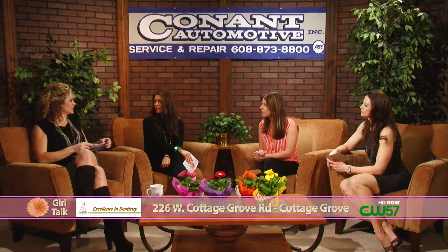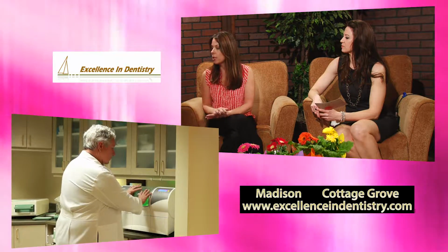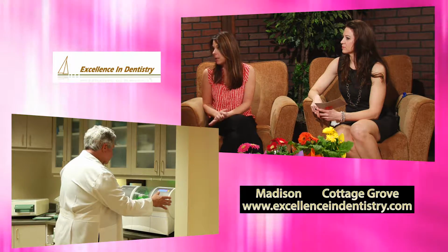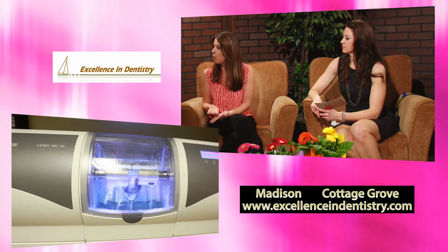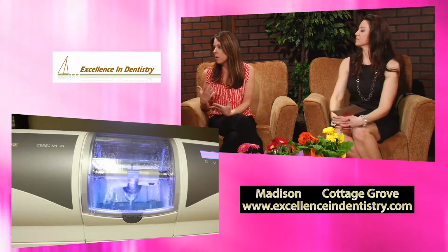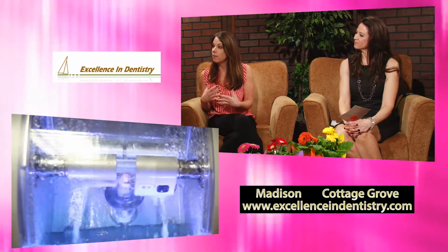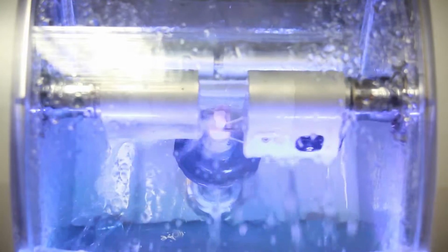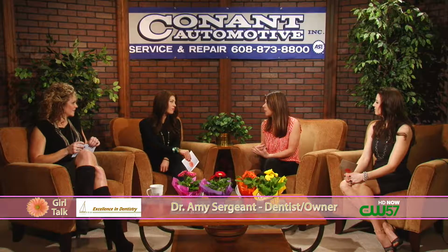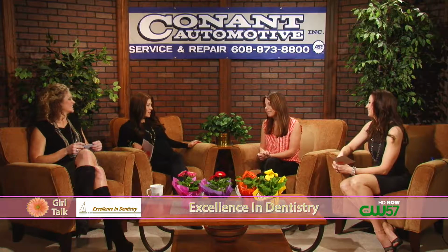So are there differences, or is the crown made of the same material as a traditional crown, or is that different too? Good question. Crowns can be made of basically 3 different materials. One would be an all gold material, which is beautiful, nice, long-lasting. And then there's a porcelain fused to metal. And then there's an all porcelain crown. I would say more commonly these days we're doing all porcelain crowns. People want the aesthetics of all porcelain, and they're a very solid material, so we can use all porcelain in many areas of the mouth. So that's what the CEREC crowns are made of, all porcelain. They're very aesthetic, and they're very long lasting as well. So no matter what face you're making, you can see it's beautiful, seamless, white.